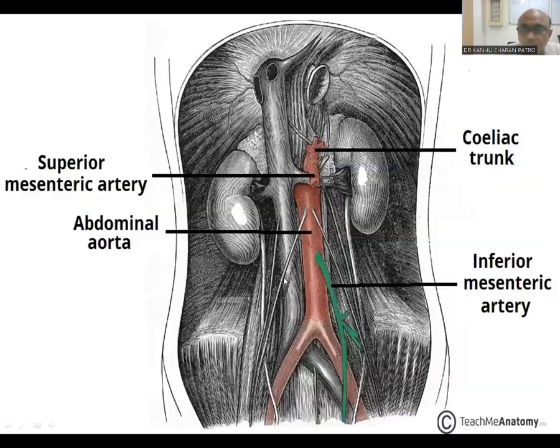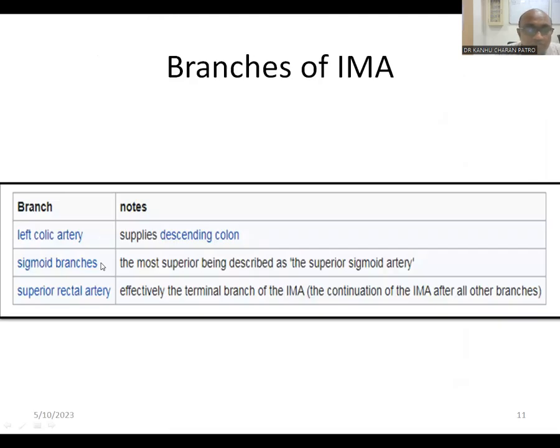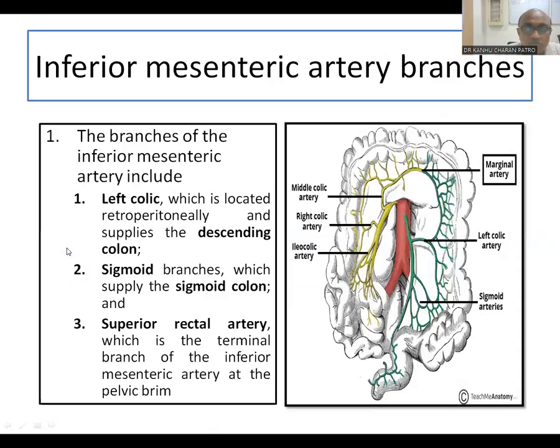You can see this is the aorta. The inferior mesenteric artery arises from the aorta and divides into the left colic artery, sigmoid branches, and the superior rectal artery. So this inferior mesenteric artery divides into the left colic artery, and then further bifurcates into the sigmoid arteries and the superior rectal artery. Identifying these vascular structures is very important to define the mesorectum.